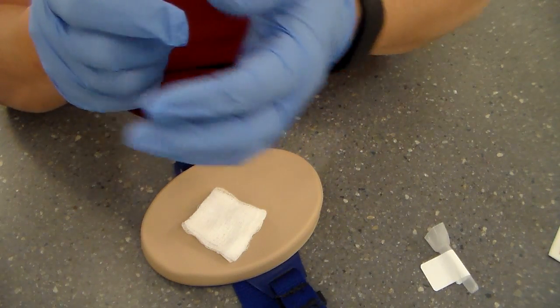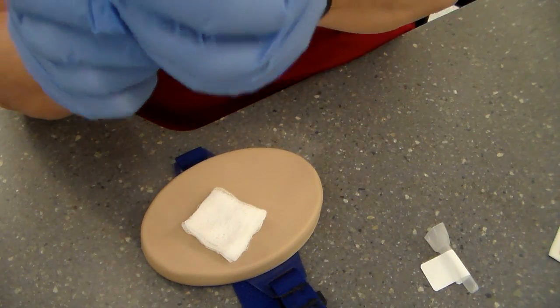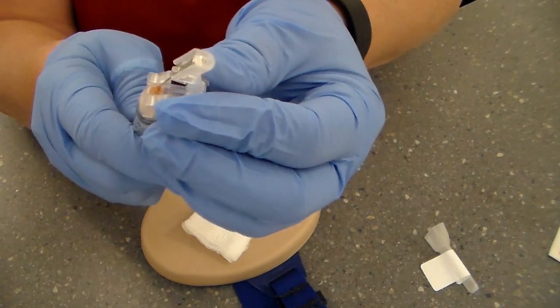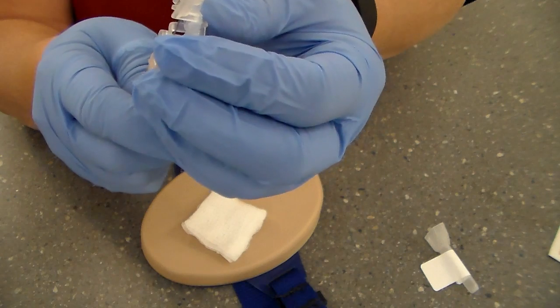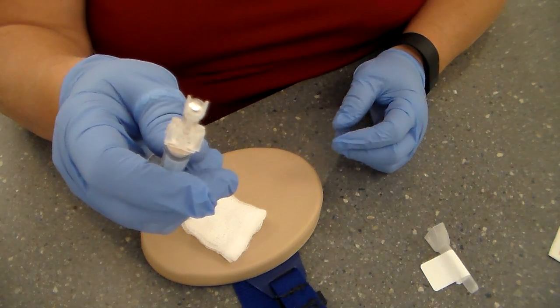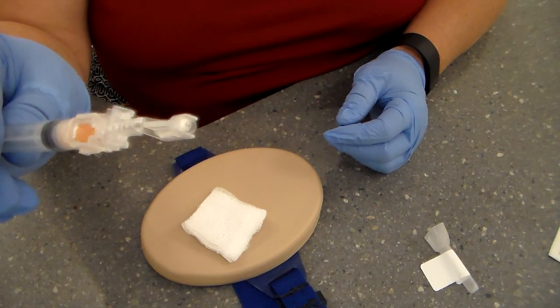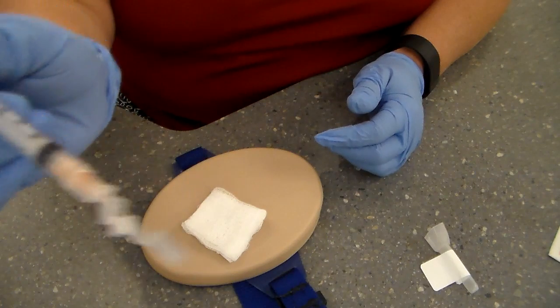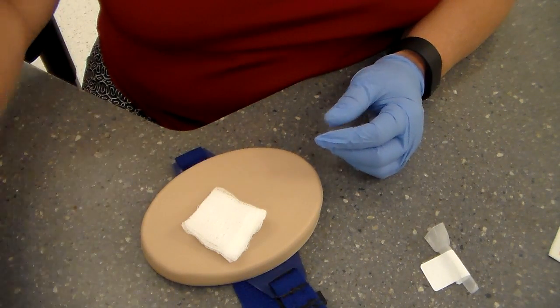This one is a simple snap-on. See, now I cannot re-expose that needle. No matter how hard I try, there's a safety mechanism in there that won't let me expose that needle. So that's now a safe needle, but still it's going in the sharps container.